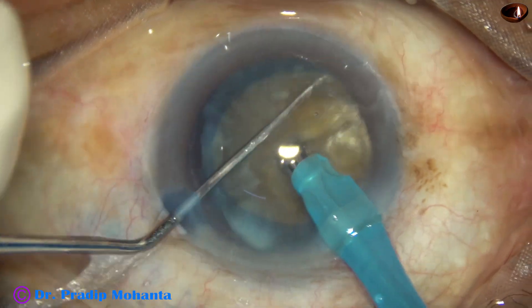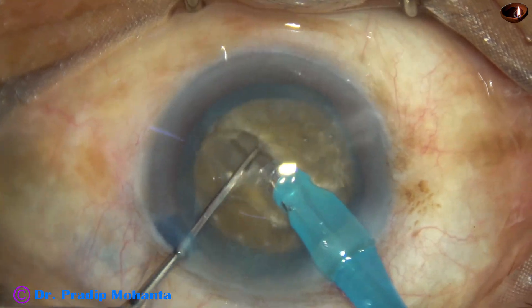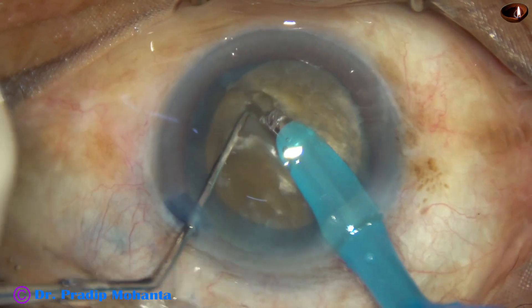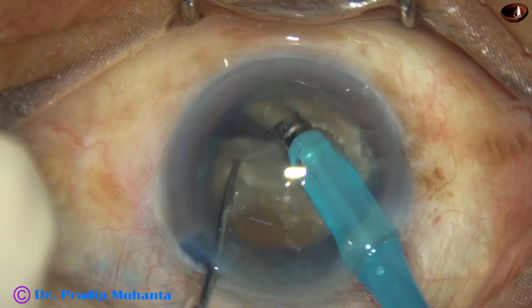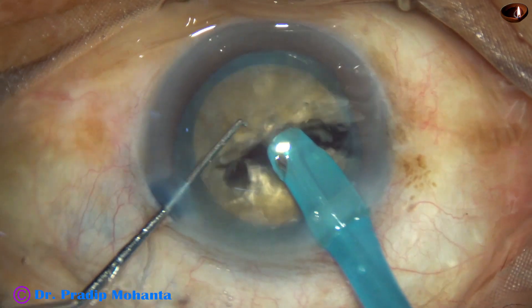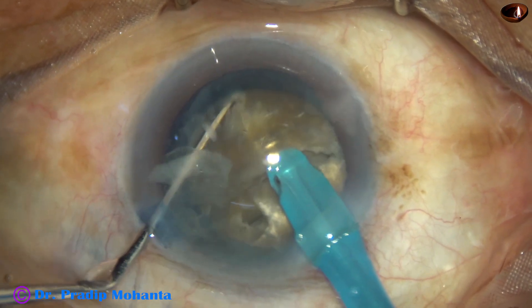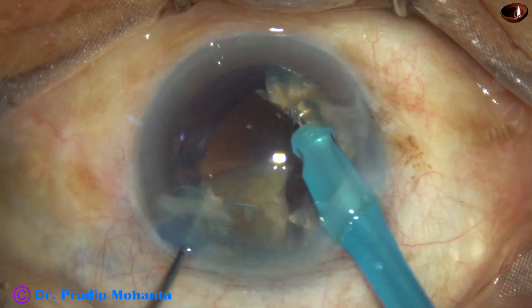The nucleus is rotated 180 degrees, a few sculpts are done to go to a deeper plane, and then the nucleus is divided completely into two hemi-nuclei. Each hemi-nucleus is then subdivided into two large fragments.